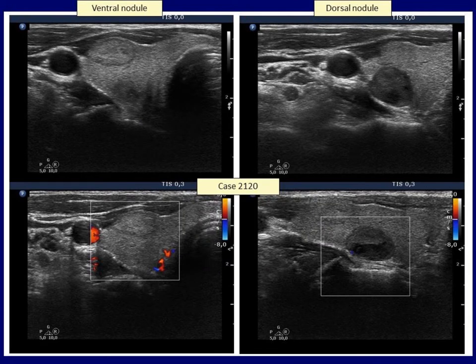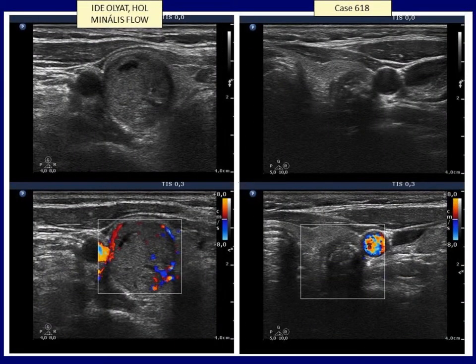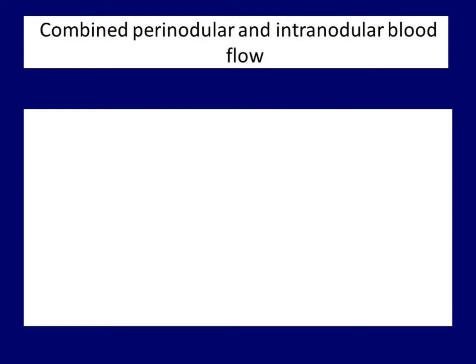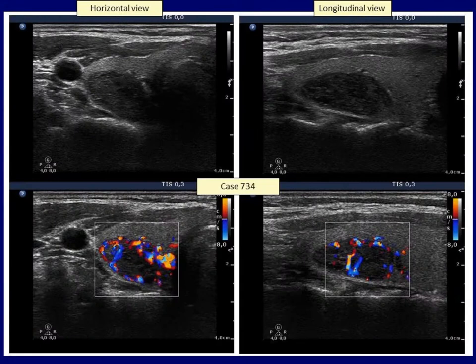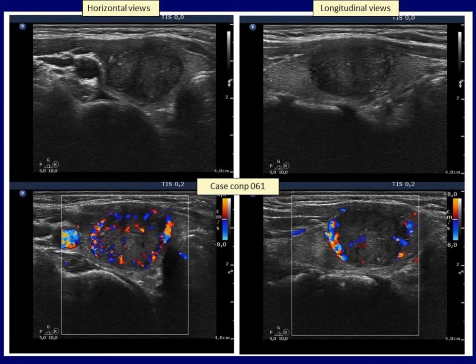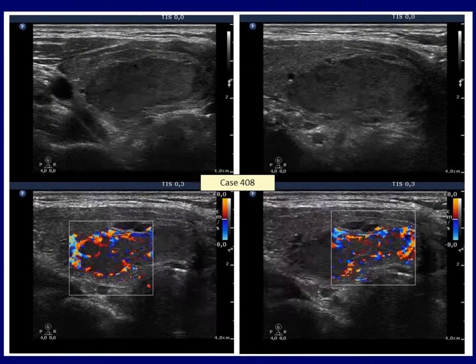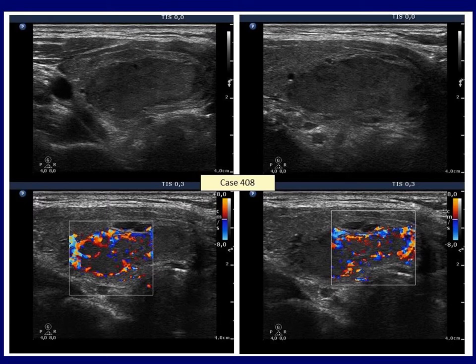If intranodular vascularization is minimal, interpretation is more prone to individual judgment. I only mention here that in most nodules with coarse calcification, we cannot see blood flow dorsal to the calcified structure. Perinodular and intranodular flows are frequently combined; in such cases I prefer describing the presence of both types rather than only the seemingly predominant one. This can be observed in a nodule that proved to be a follicular adenoma, as well as in a lesion that proved to be papillary cancer, which showed both perinodular flow and regularly distributed increased intranodular vascularity.